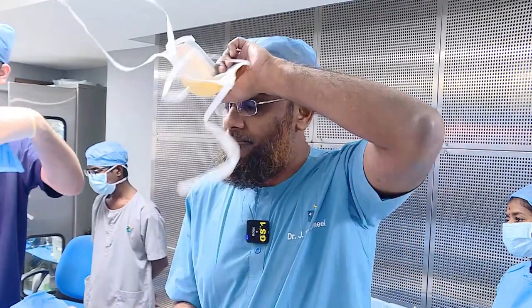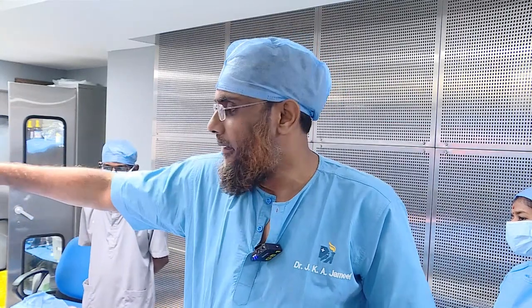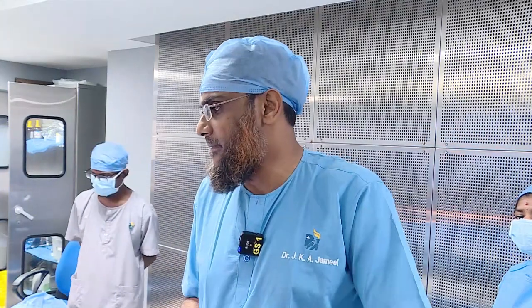There's one other important history of note. We'll show you when we scrub up, he has an upper midline incision from an operation that he had about 30 years ago. We don't have the details of it. He seems to think that it is some kind of a stomach operation. I can only assume that it was an ulcer operation. So we won't know what it is until we go in. So that's essentially the history, sir.